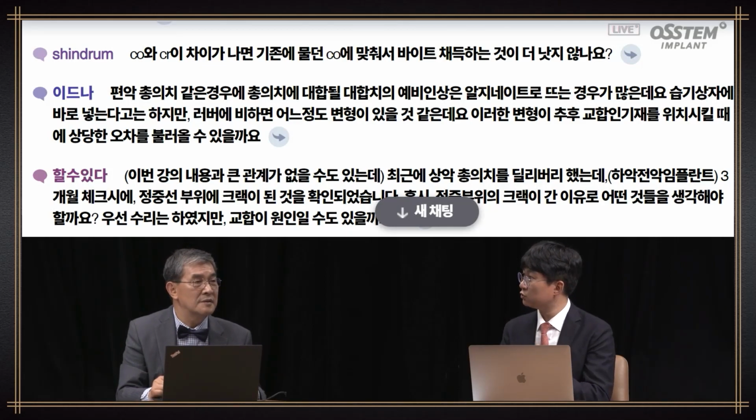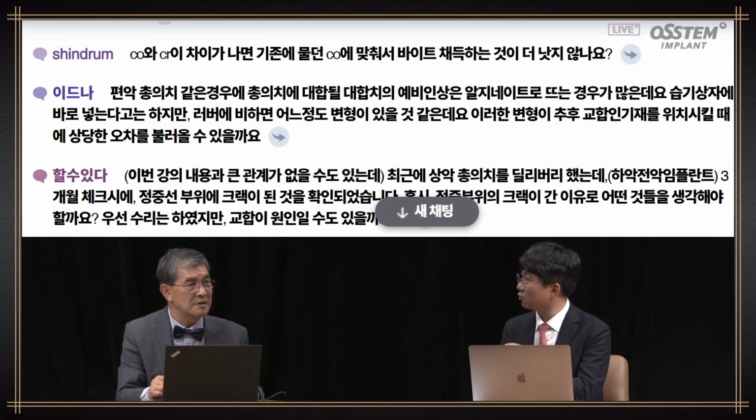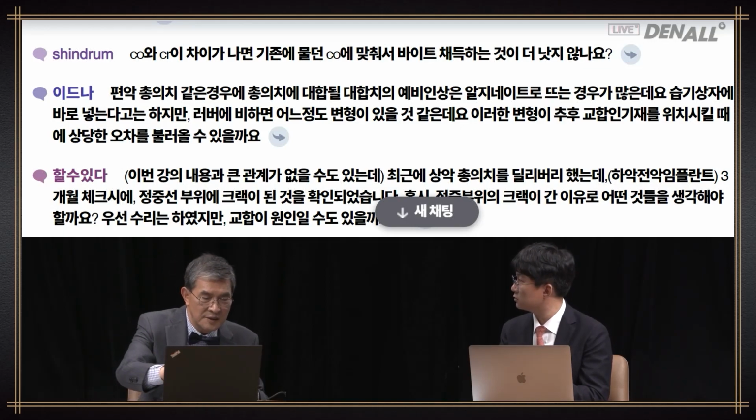If a patient's denture has appropriate vertical dimension and proper occlusion, the patient can chew pretty well bilaterally, and the muscles can change a little bit to a comfortable position, and the tapping point is too far from it. As you begin to use the muscle, the jaw can change a little bit if the patient is chewing in the too forward position, for example, so it depends.